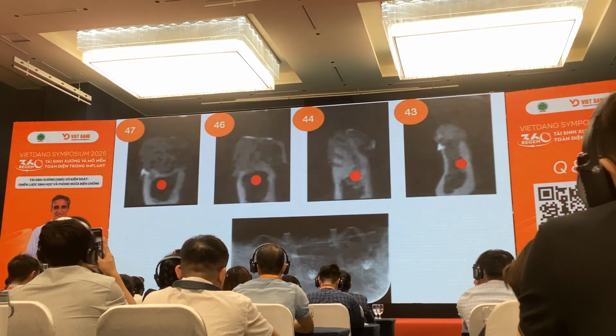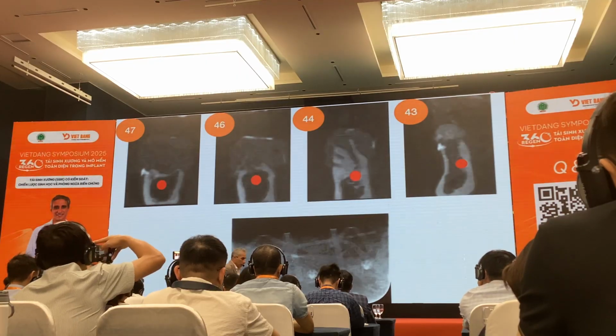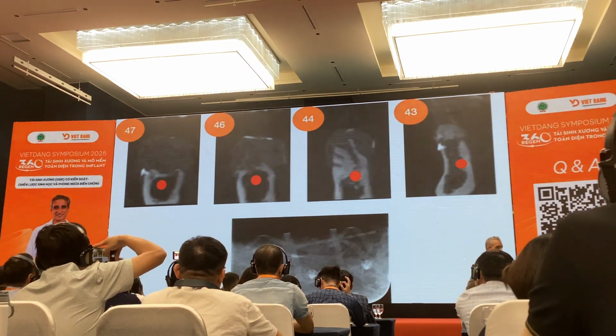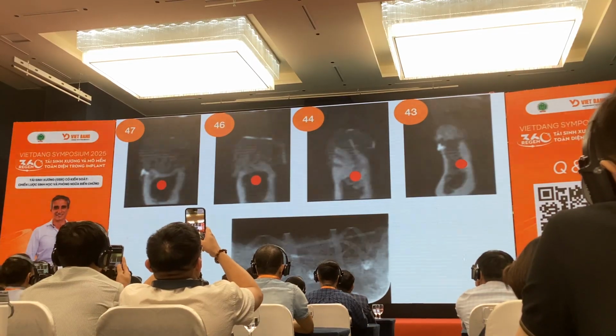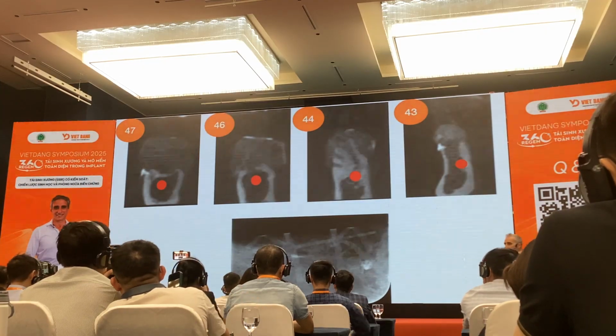This was the CBCT at the time in which I had to remove the membrane, the same day or the day before the removal of the membrane. You can see that the quality of bone is poor.